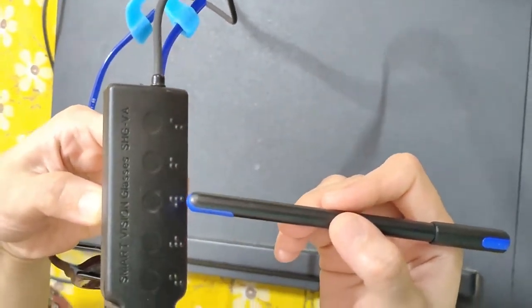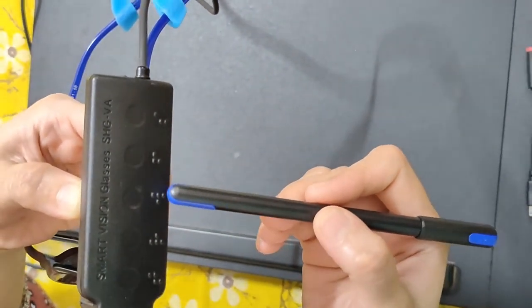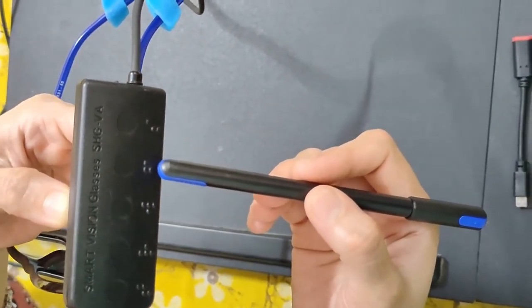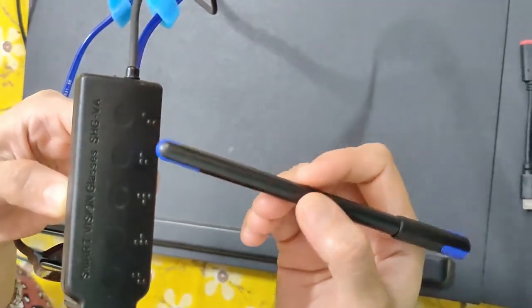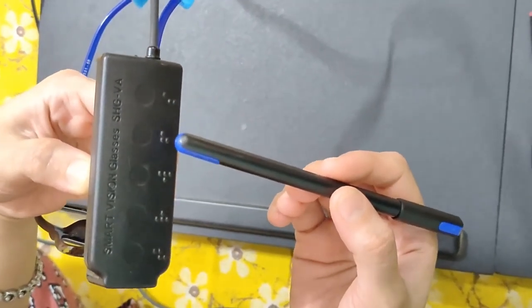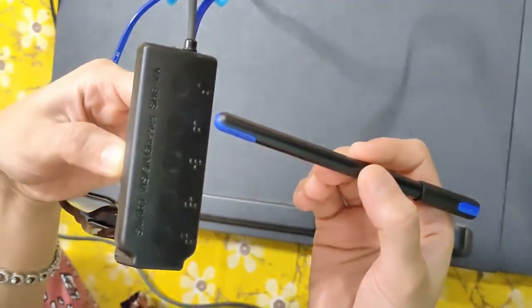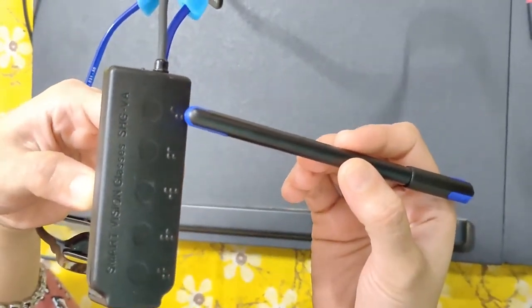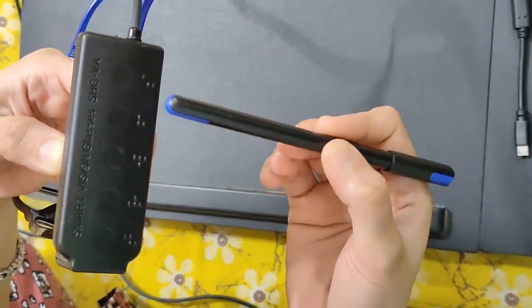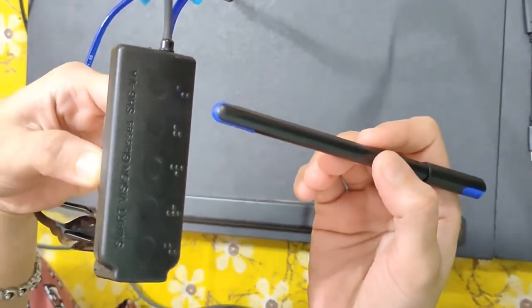Whenever a blind person starts walking, the W function will tell them how far away an obstacle is. The fourth one is marked F, which is for storing faces — the blind person can store up to 30 faces of known people around them. The last one is S, which stands for standby mode. To change any of these functions you have to click the standby mode button.